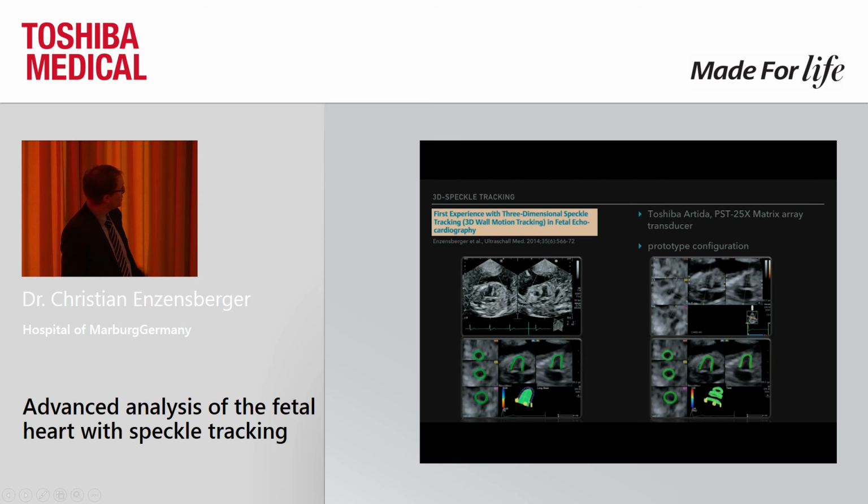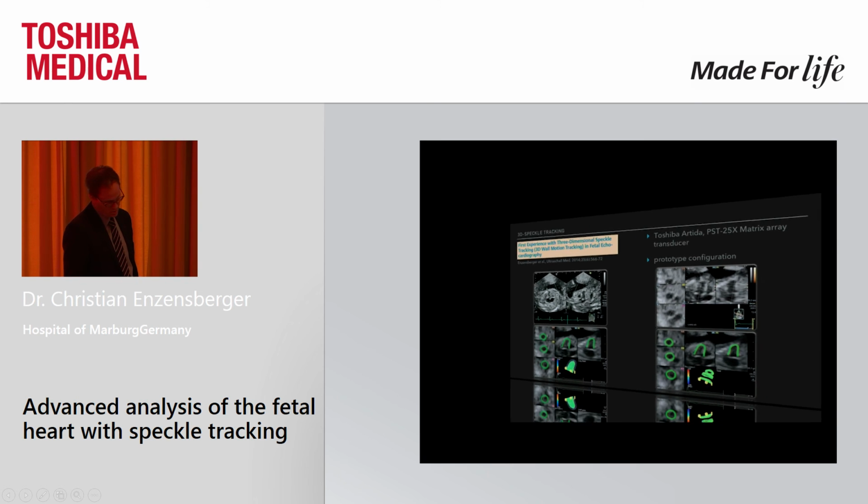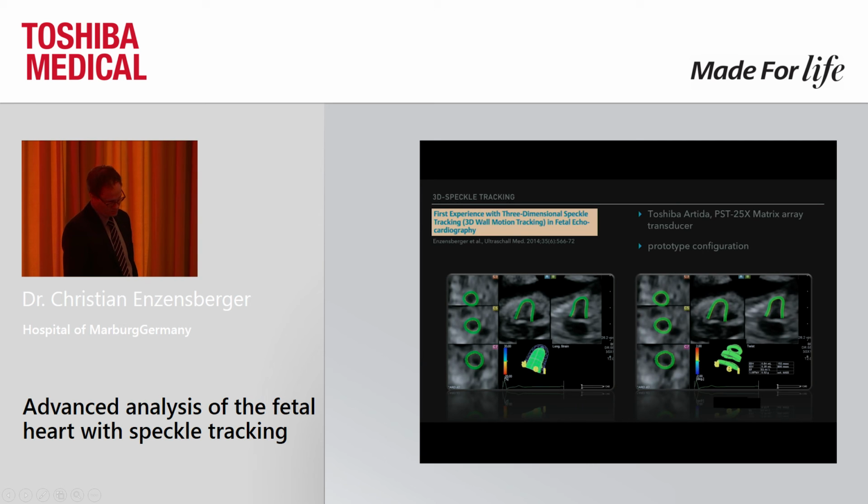When you are confident with this acquisition, the system automatically creates 3 short axis views displayed on the left side of the screen. And according to the things I told you before, you can see different possibilities of displaying your results, longitudinal strain, or even the twisting. Now we can skip this because it's the same.